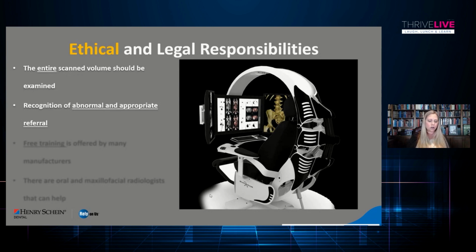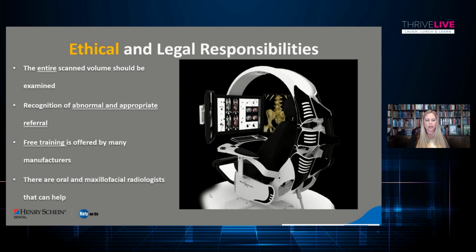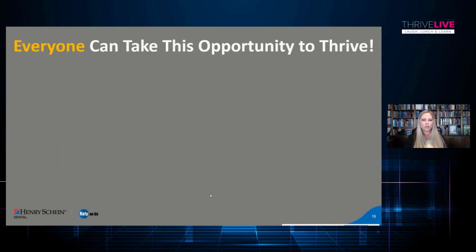So again, if you ever are concerned, you're not sure what you're looking at, you can always send to a radiologist. Free training is offered by many manufacturers, as I stated. And again, there are oral maxillofacial radiologists across the country that are more than happy to help. We're very service oriented. We are very excited to be able to be part of your diagnostic imaging team. We know this is not something that we're born knowing. And so we're definitely here to help, and just kind of think of us as the radiologist in your pocket. So we're here for you.